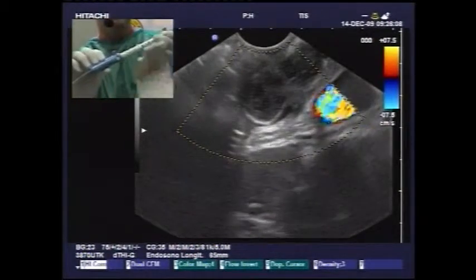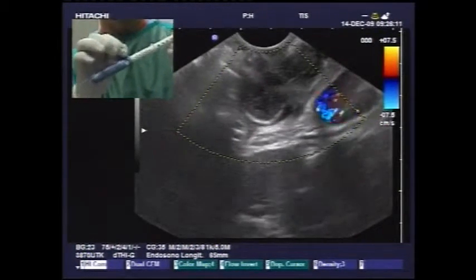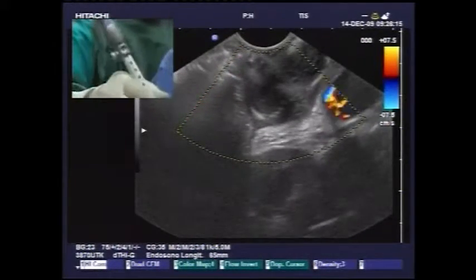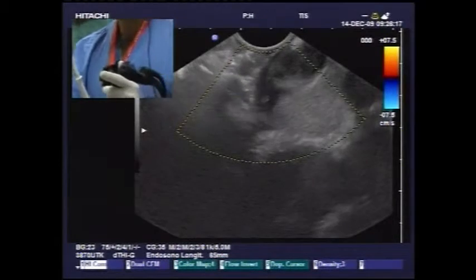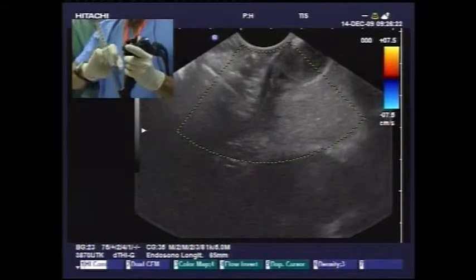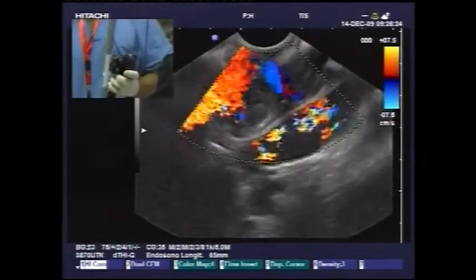This is very important because I can adjust the outer sheath when I am inside the working channel. So I can fix my needle to the working channel easily, and I find the right position.